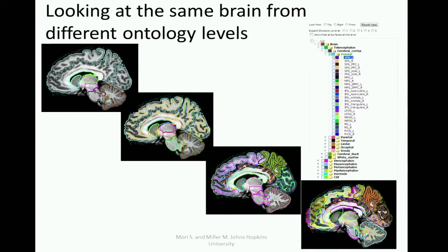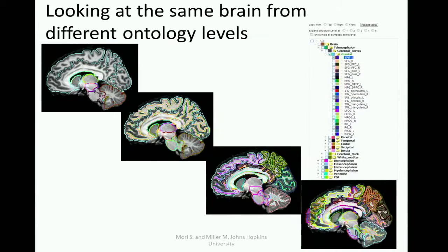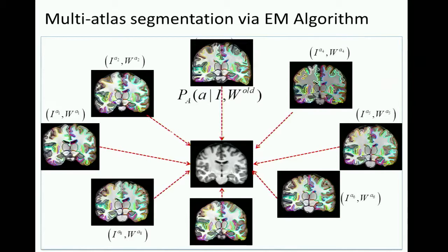So now once we establish this structural representation and assign names, we now can link the way radiologists record their observation and the way we quantify the brain. Now, the question is how we divide, segment the brain like this. And there are many ways to divide the brain. There are tools like the free software FSL, and we also have MRI Studio that does automated brain segmentation. But this technology has developed considerably in the last 10 years when multi-atlas segmentation tools became widely available.